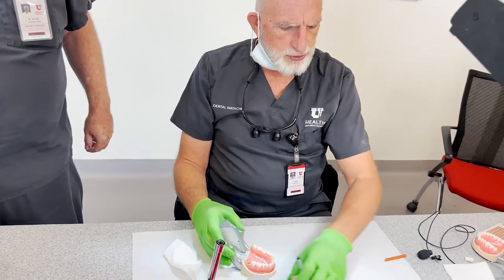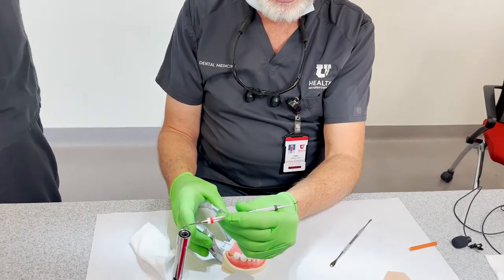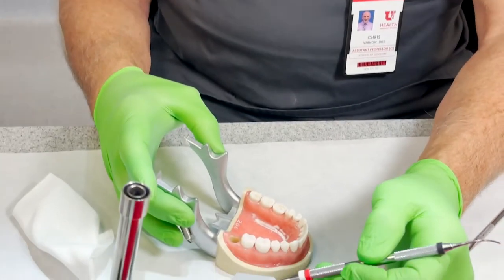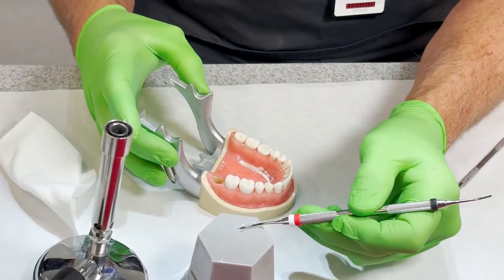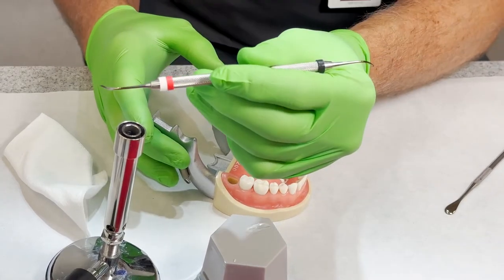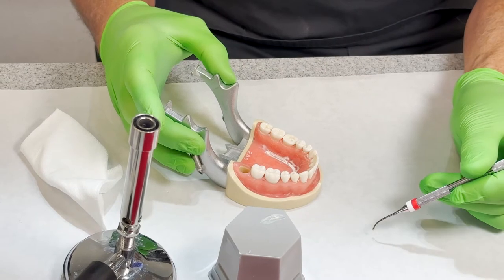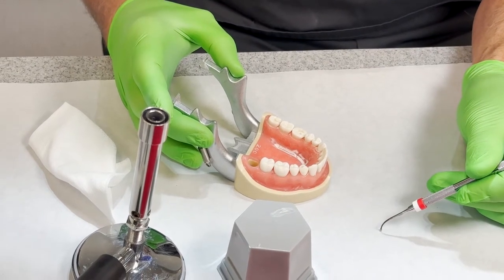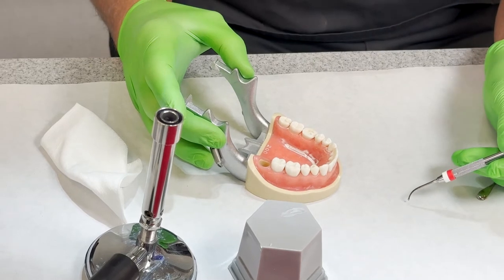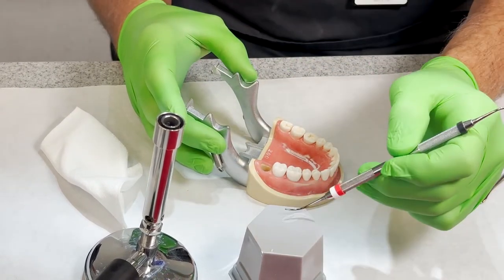I'm going to start off with the gray, and I'm just going to check here and see. Again, like I say, I'm kind of new at this too. So with this little instrument, you heat the back of it, and then it will flow the drop that you want to the tip of the instrument. Okay, maybe we'll see here.